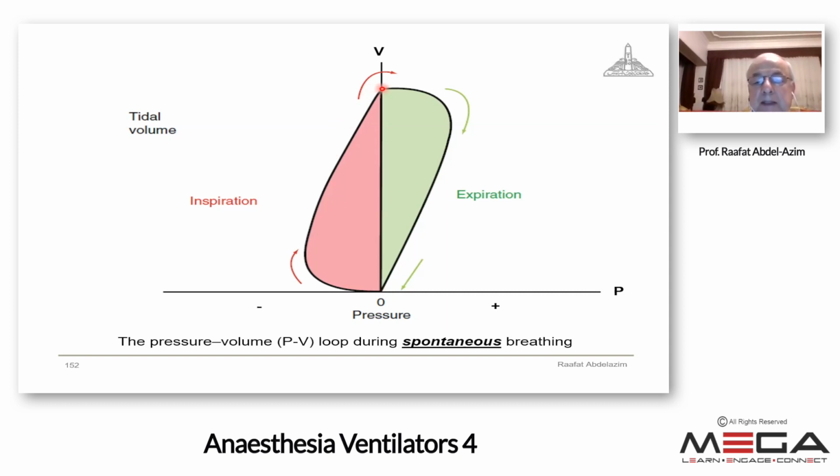Here, we can say that the pressure is again 0, because it decreases during inspiration to -1, and at the end of inspiration, it will go to 0. And the tidal volume is the maximum volume reached here on the display. So this is the end inspiratory point, in which the pressure is 0 and the volume is the tidal volume.